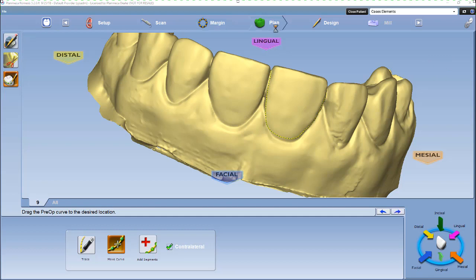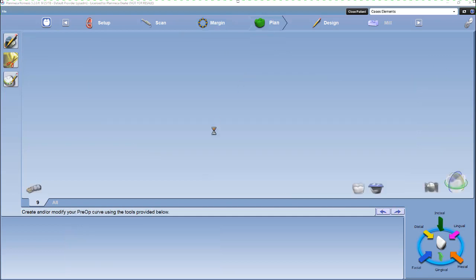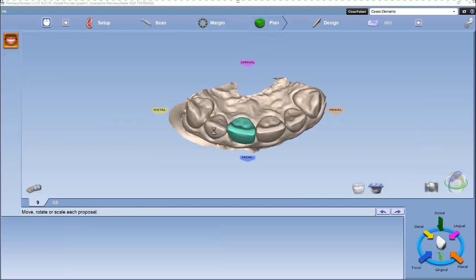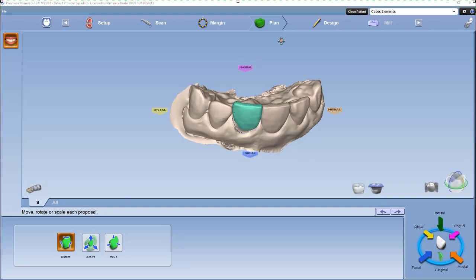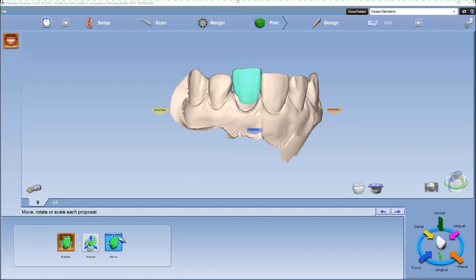Then we'll go ahead and go to the plan tab. You can go ahead and rotate or move the tooth if we need to, just so it fits in its spot correctly.